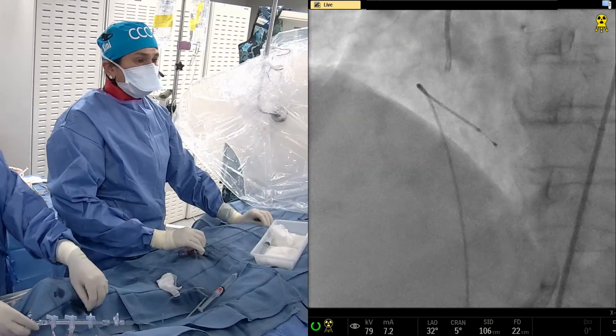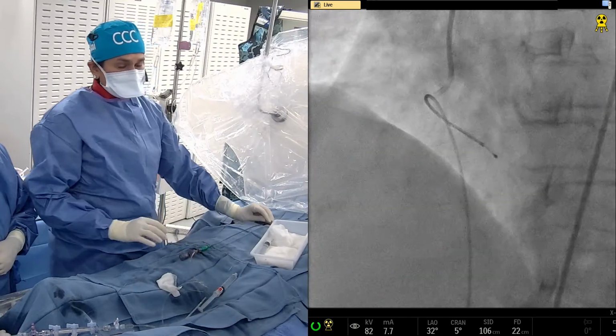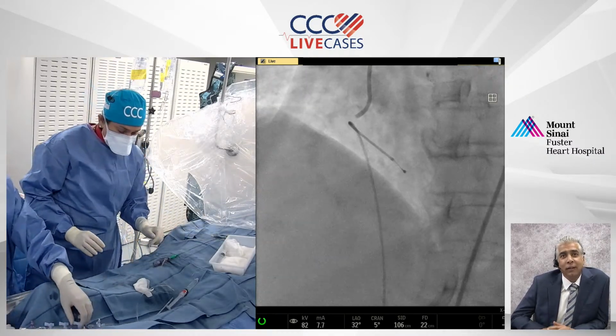Any questions so far from the audience? Okay. Yes, actually one just popped up. Nowadays we are using saline OCT. Any comments? Kiski, tell us.